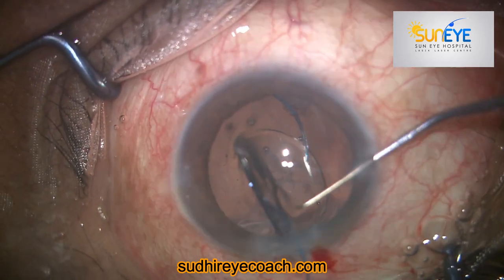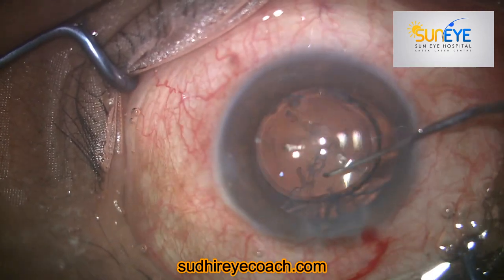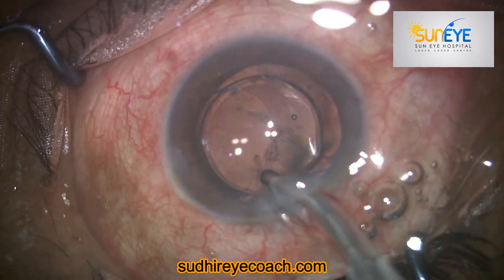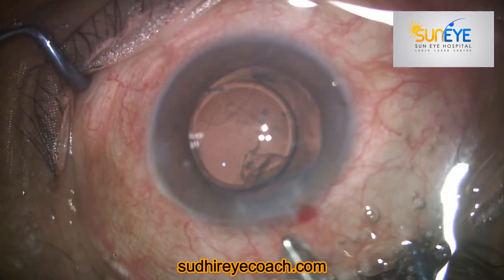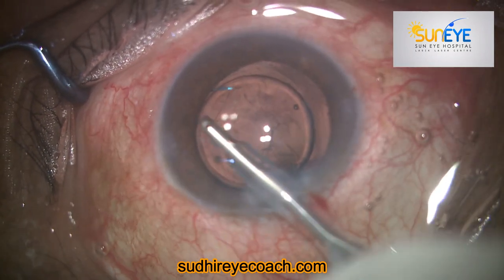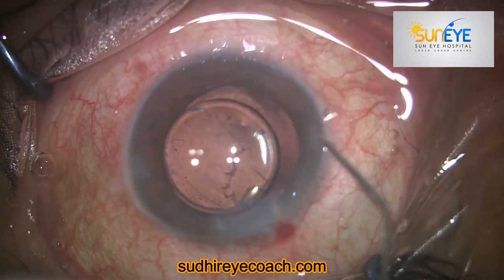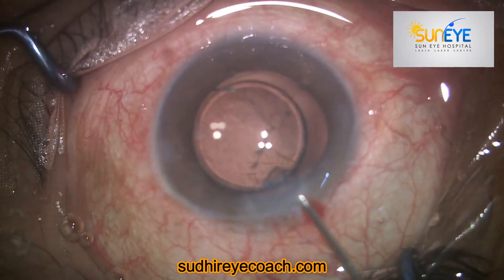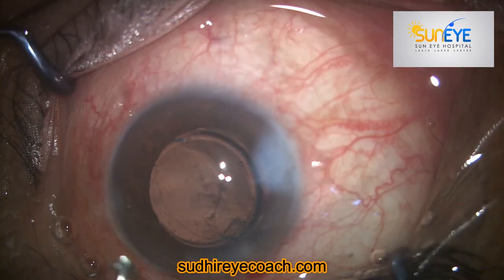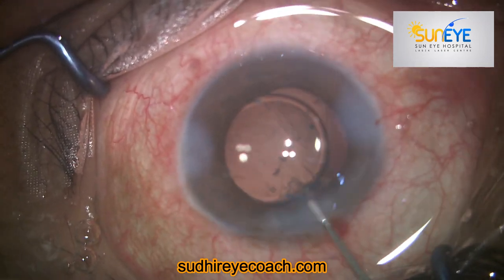Luckily there was no dislodgement of vitreous and no vitreous was present in the anterior chamber. With gentle aspiration I aspirated the remaining cortical matter present in the bag. I was fortunate to finish this case without much problem, but I realized later that I made several mistakes. Because the outcome was good, we came out without any problems. Thank you very much for watching.